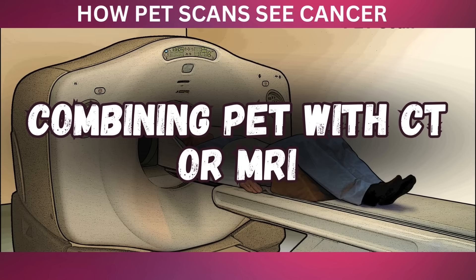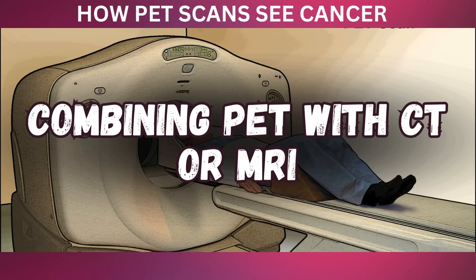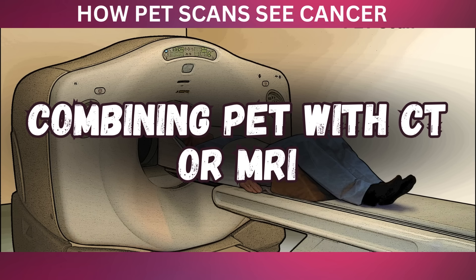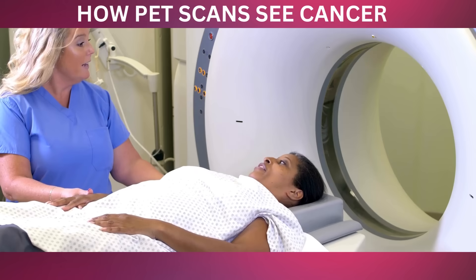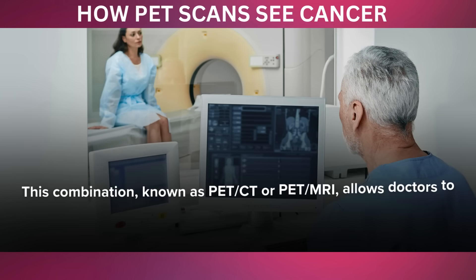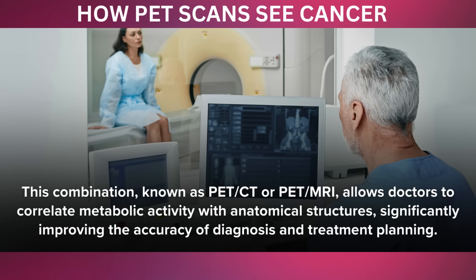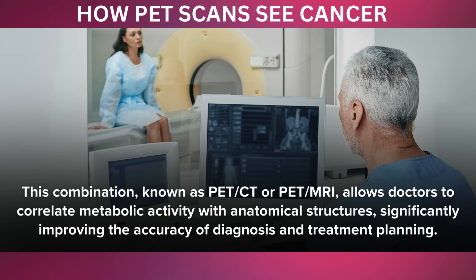Often PET scans are combined with CT, computed tomography, or MRI, magnetic resonance imaging, to provide even more detailed information. This combination, known as PET-CT or PET-MRI, allows doctors to correlate metabolic activity with anatomical structures, significantly improving the accuracy of diagnosis and treatment planning.